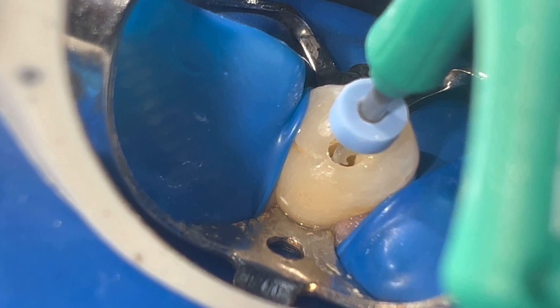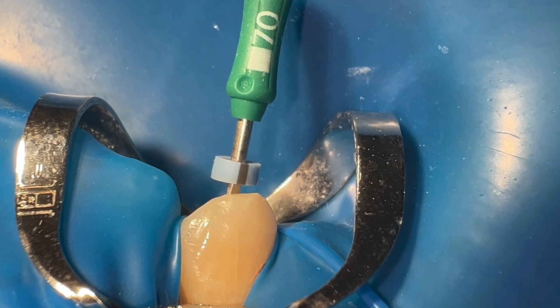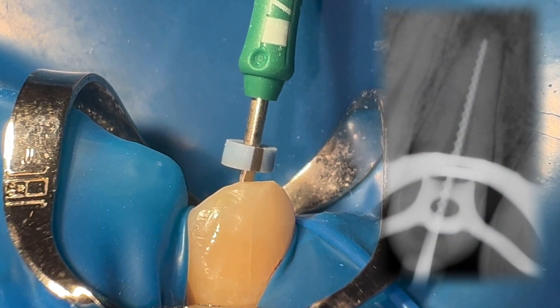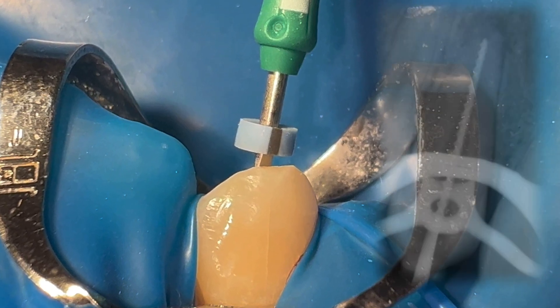Working length was determined with the apex locator and copious irrigation with 4.25% hypochlorite was performed. Normally, when the apical stop is 60 or greater, I always use a bioceramic material such as MTA.